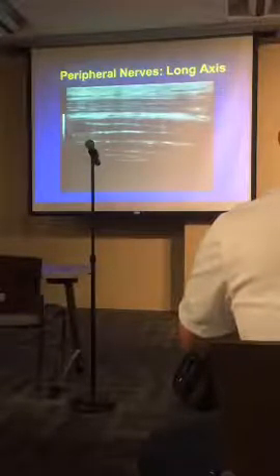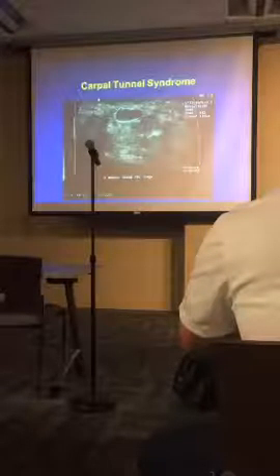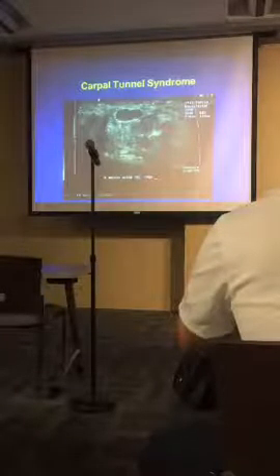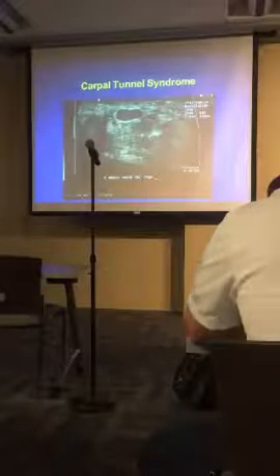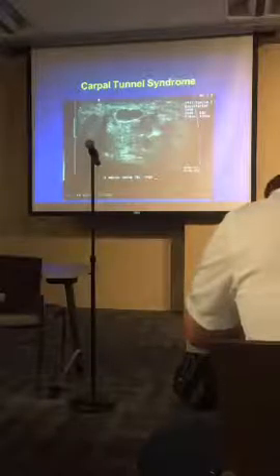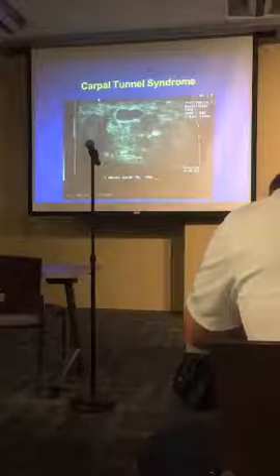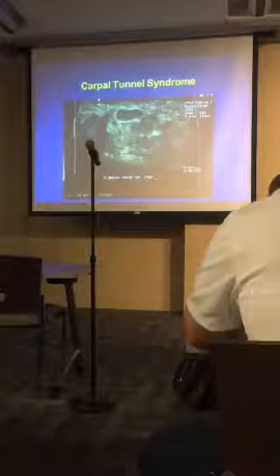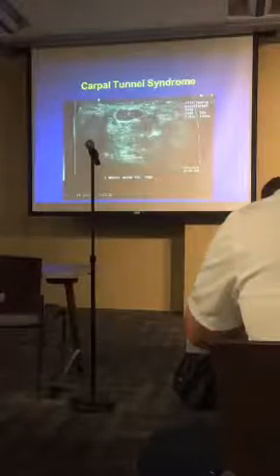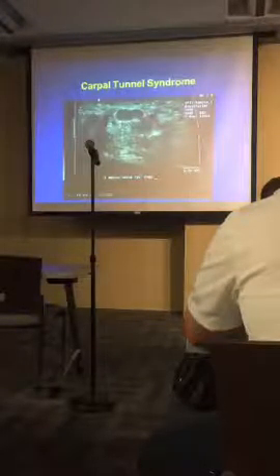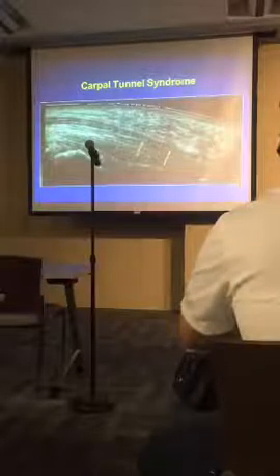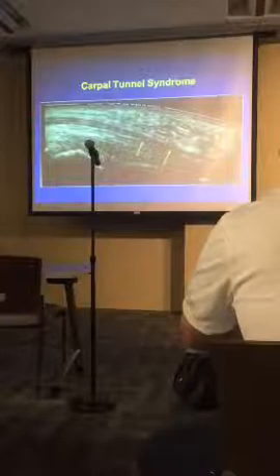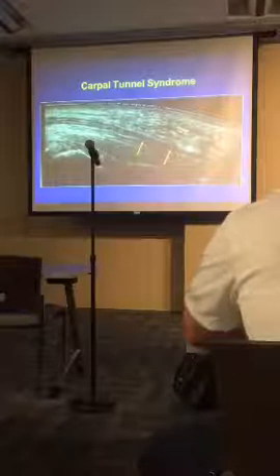When nerves are abnormal, you usually lose the fascicular pattern and the nerve becomes more homogeneously hypoechoic. There is normally a certain amount of fluid circulating through a nerve; if you constrict the nerve it's like putting a dam on — fluid backs up, the nerve swells and gets bigger and more hypoechoic, with the fascicles crowded out by the connective tissue. In carpal tunnel syndrome, the median nerve is about twice normal size. Following it from proximal to distal in the long axis, you can see an area of narrowing caused by a thickened transverse carpal ligament, which is creating the syndrome.